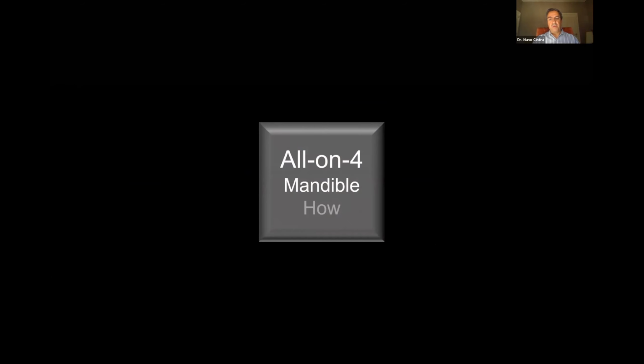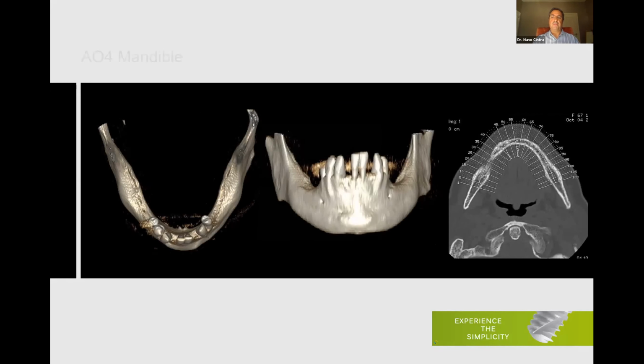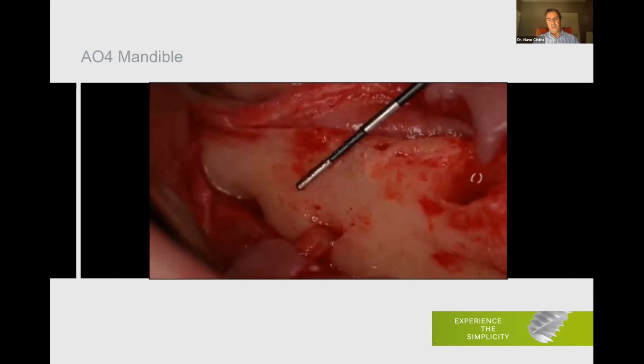So how will you do the all-on-4? Well, if we don't have full bone volume, it's more or less the same as in the maxilla, except that now our posterior limit is the mental nerves. And we should identify and explore the mental nerves.